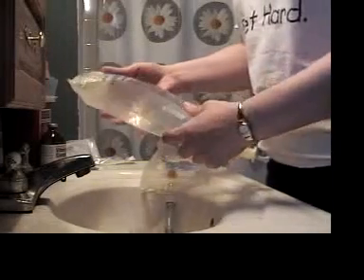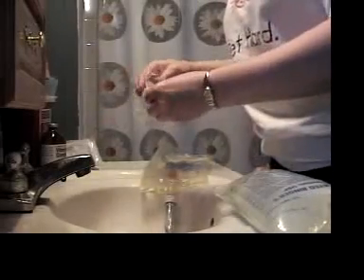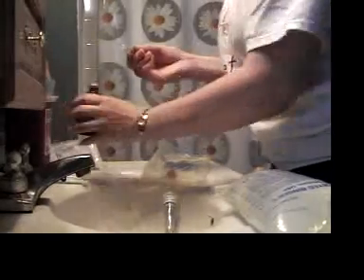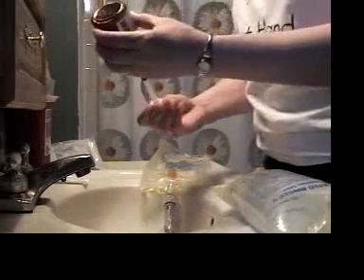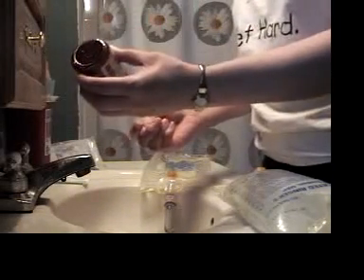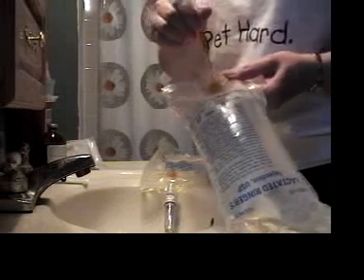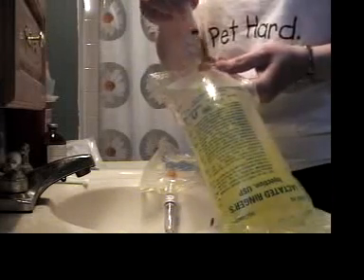lactated ringers with vitamin B complex injectable. Vitamin B complex, when it's injectable, is only available by prescription from your veterinarian. But I simply draw up the B complex that I need in a syringe. Then I add it to the bag of fluids simply by injecting it into this yellow injection port. You can see I've added that.